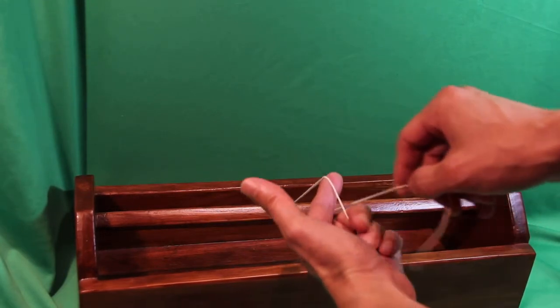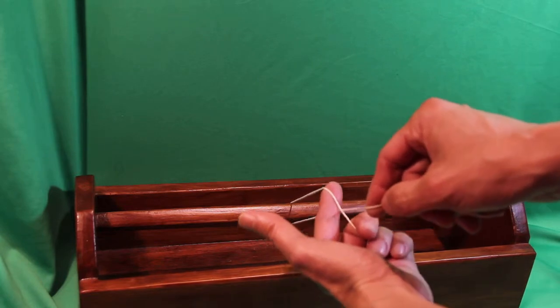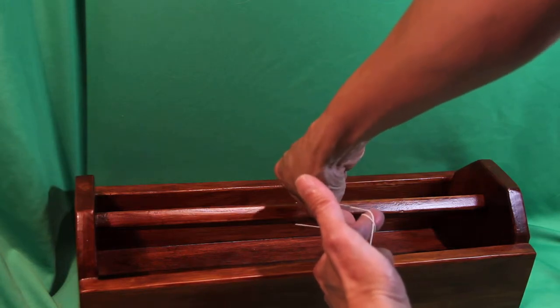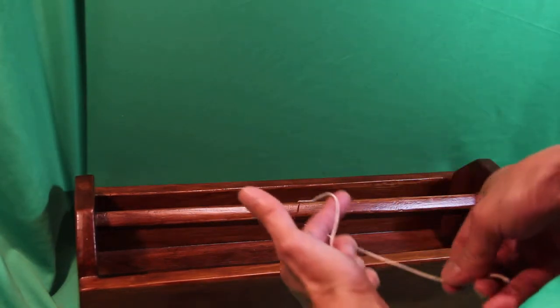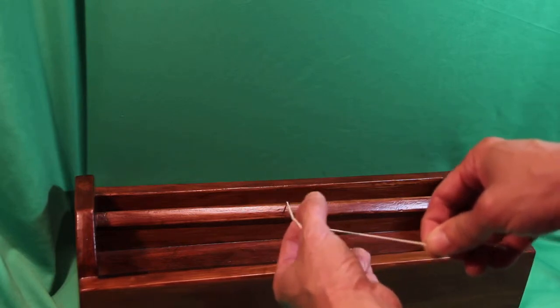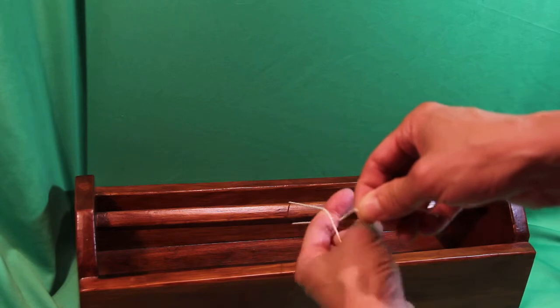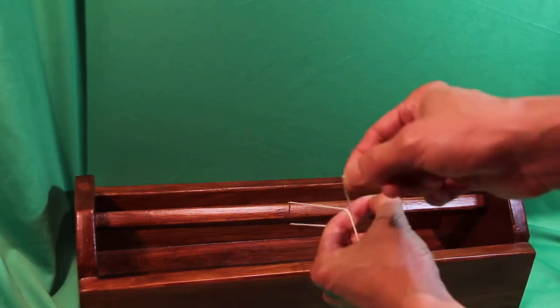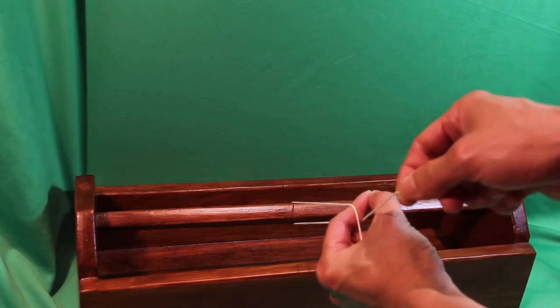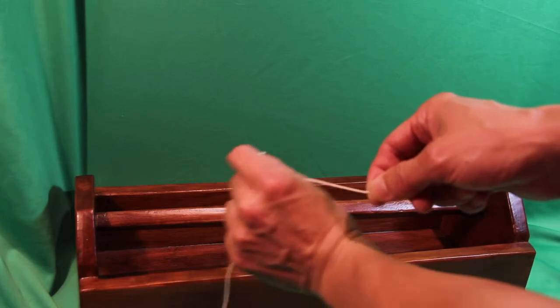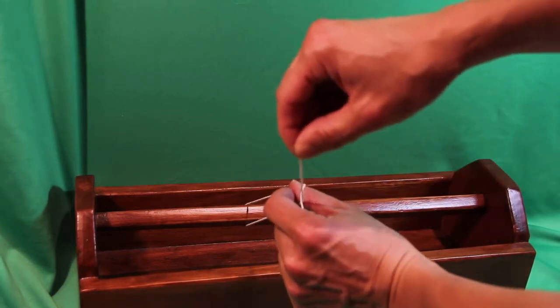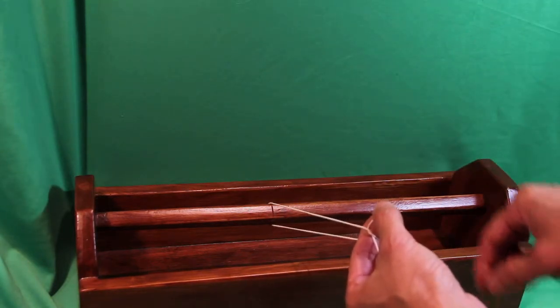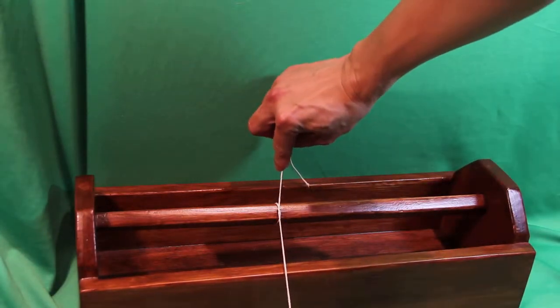Then you cross. You create a cross. Your goal is to get this end through this loop. So the best way to do this is you pinch your index and thumb. Notice how the cross is between the two digits. You pinch and you come across and you pass the strand to the index and thumb and bring it through. And that's how you get the thrust through. And that's how you get the first throw.